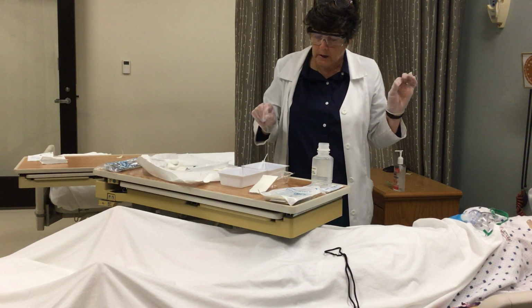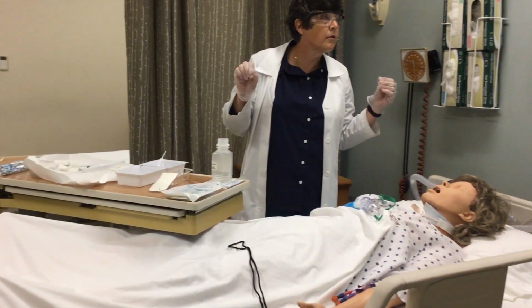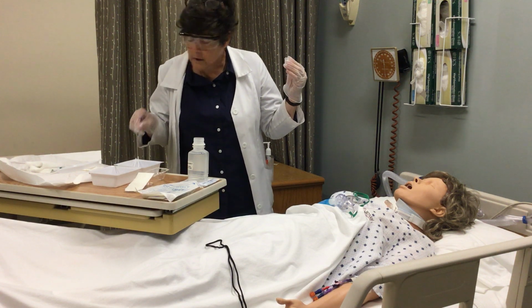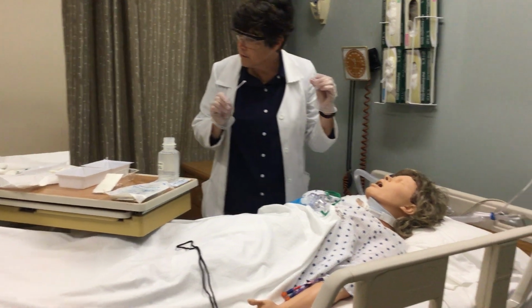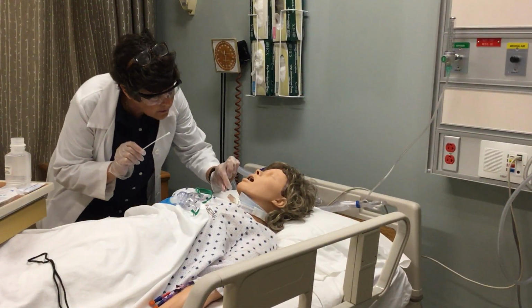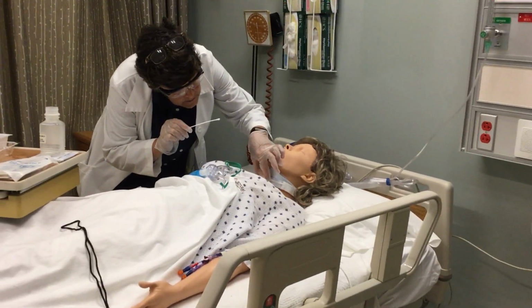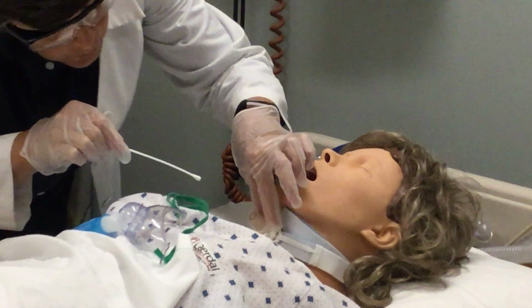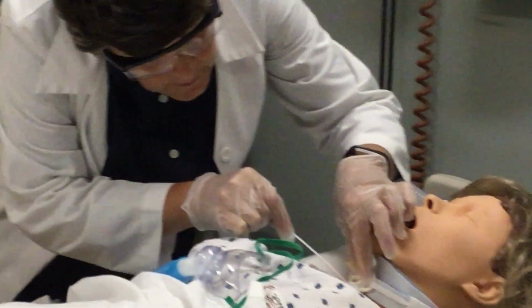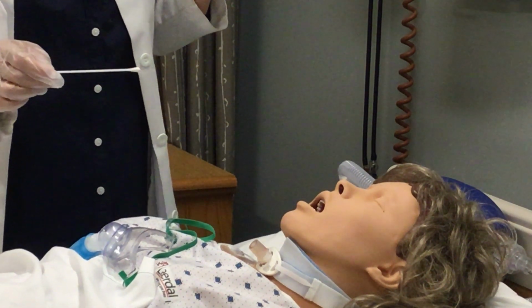Now, patients that have tracheostomy tubes sometimes don't have the capability to either flex or hyperextend their neck, so you do the best you can to clean around the stoma. If need be, if you think you don't want to touch that, you can take a gauze from the kit. If not, I'm just going to gently move this part of the tracheostomy tube, this flange, because it rotates or pivots. I usually clean in one stroke, usually 3 to 9 if you're looking at the hands of a clock, or 12 to 6 depending on how you can get in there.